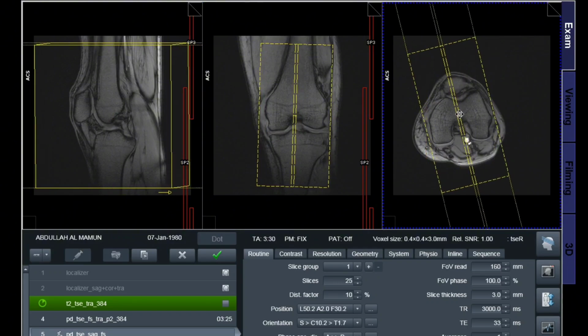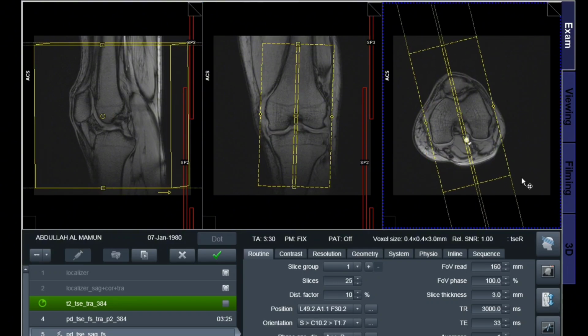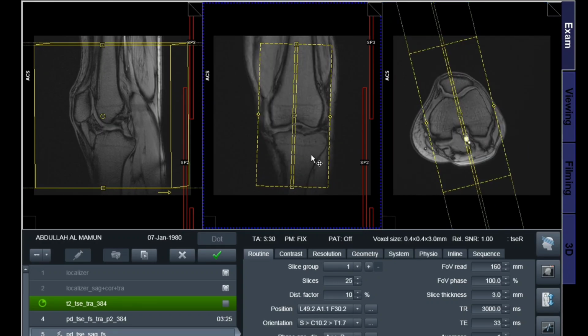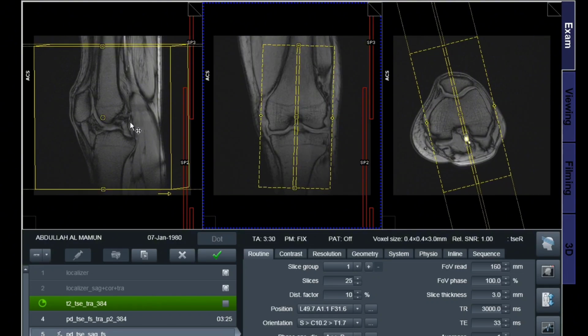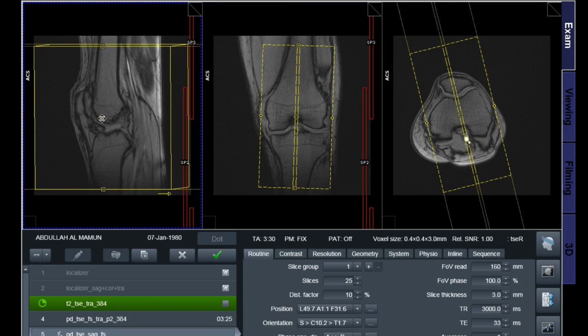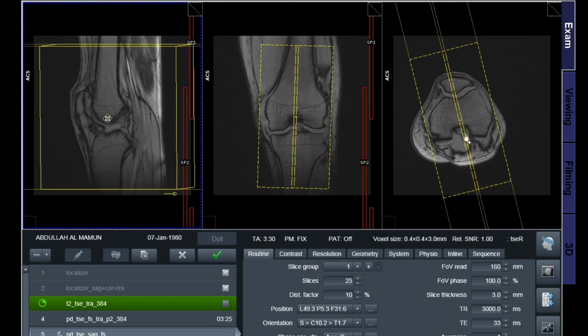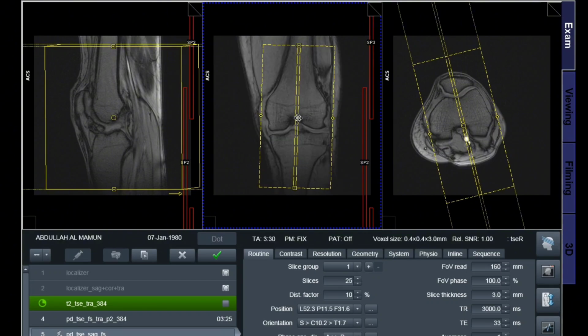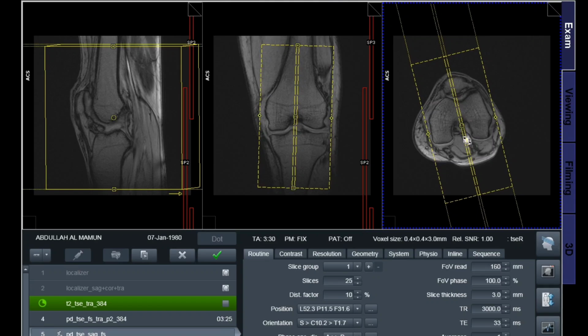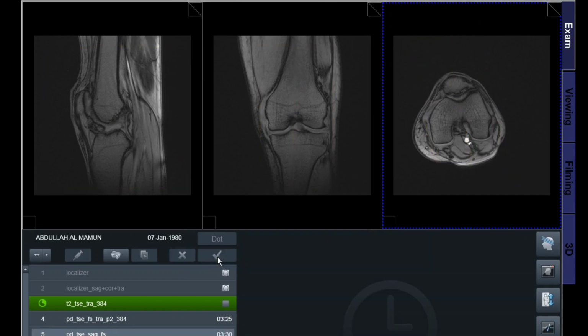Why is MRI left knee done? Doctors usually advise MRI left knee when a patient has persistent knee pain, swelling of the knee joint, difficulty in bending or straightening the knee, knee injury due to accident or fall, sports-related knee trauma, knee locking, instability, or clicking sound, or an unclear diagnosis after X-ray. MRI helps identify the exact cause of knee problems.